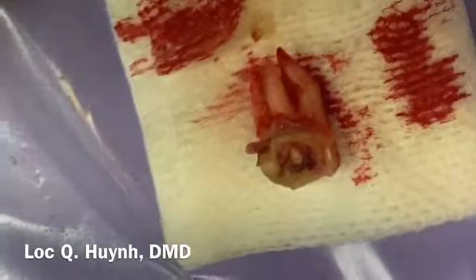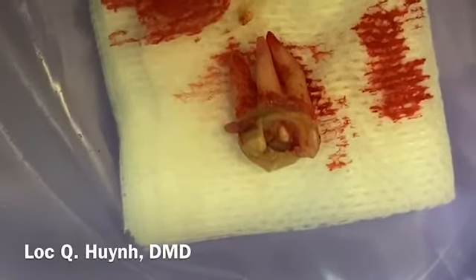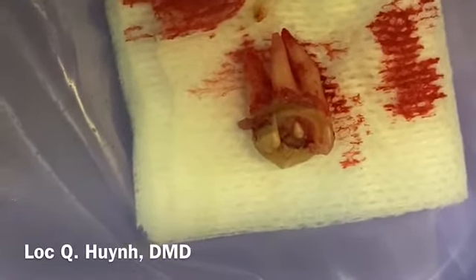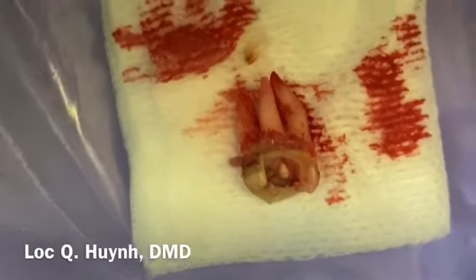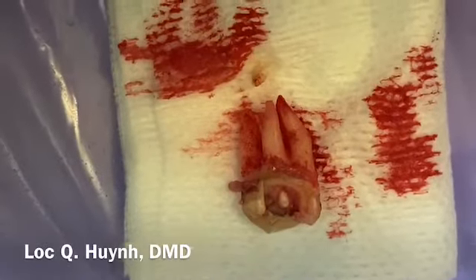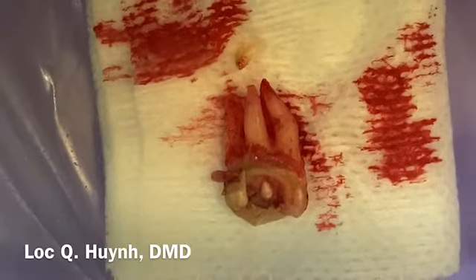Also, when I was trying to luxate the tooth, it was very firm. Part of it is because of the 3-root tooth, which requires a lot of luxation, a lot of elevation from the mesial, at the point between the mesial of number 1 and number 2.